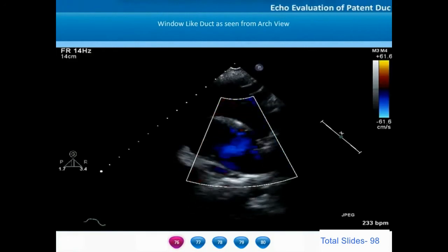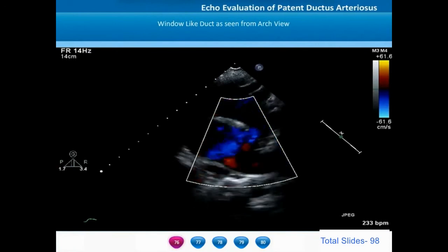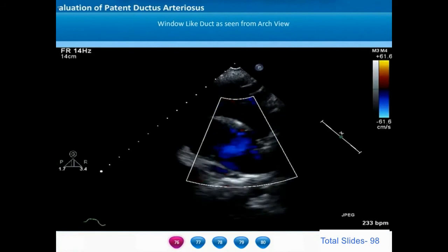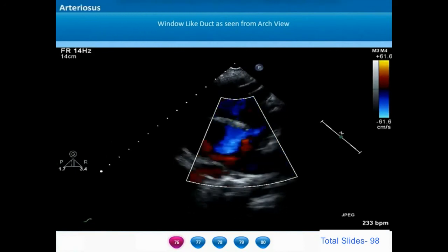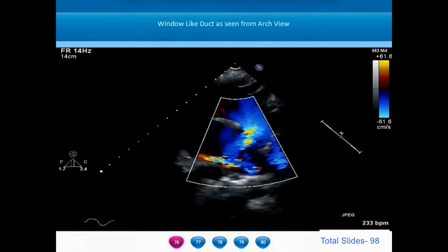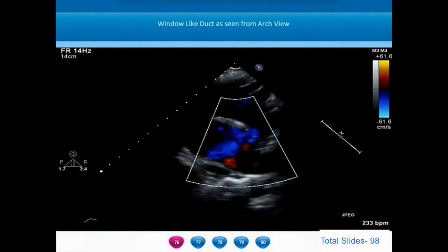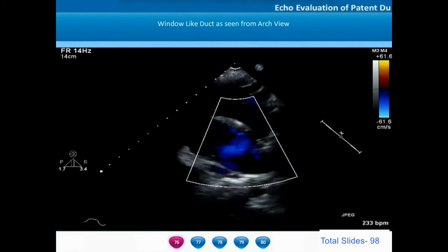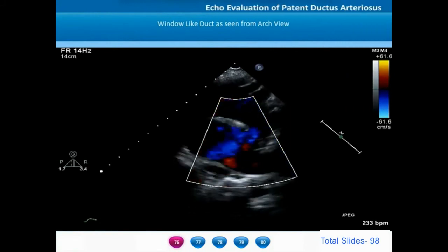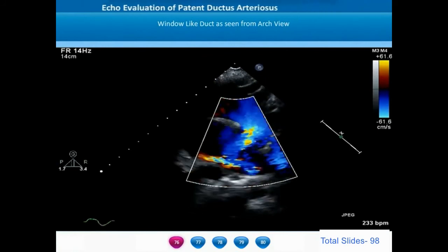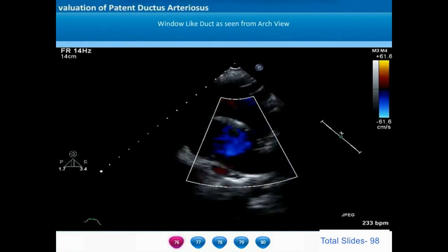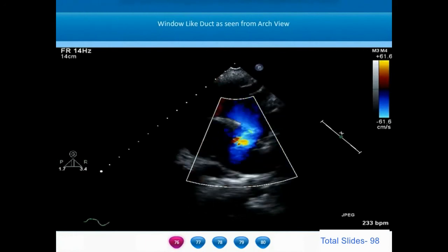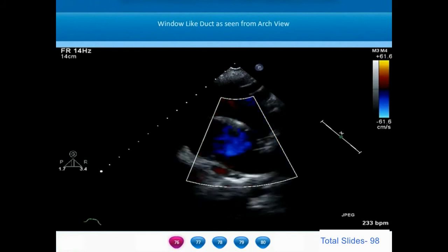The suprasternal ductal view clearly shows the lack of a ductal ampulla. These window-like ducts are very short and don't have a length at all. Some may be very large in diameter such that the aortic pressure and pulmonary artery pressure are similar. In this suprasternal view, we notice laminar flow of blood from the aorta towards the pulmonary artery without any gradient, indicating that pulmonary artery pressures and aortic pressures are similar.